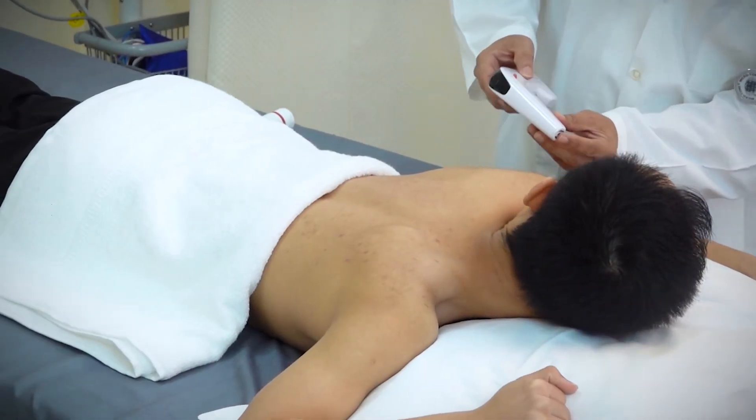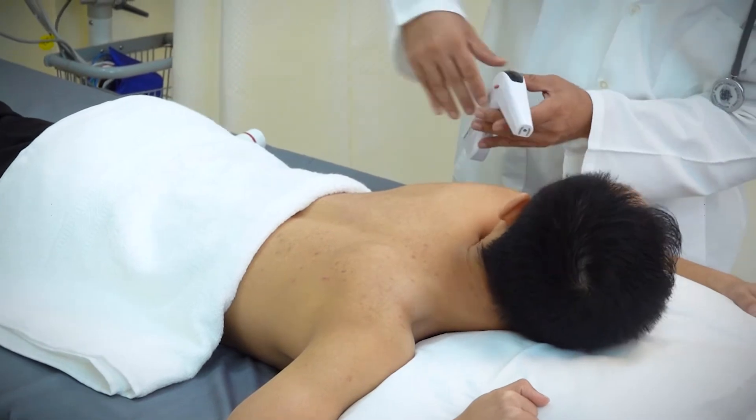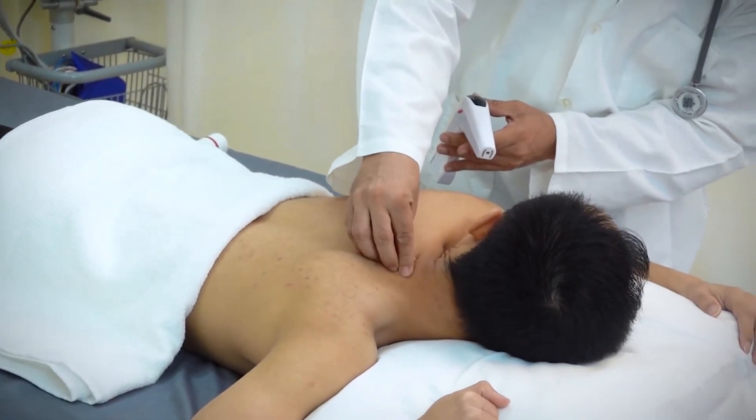The surface area of the neck is small, so use the small therapeutic head to cover the whole area in a single treatment session.